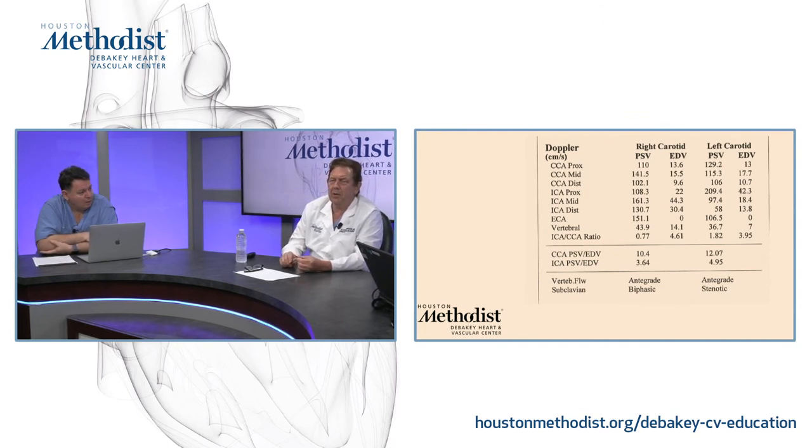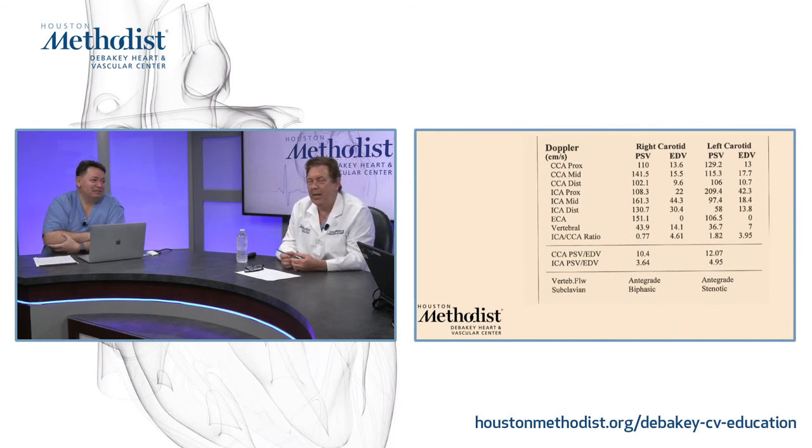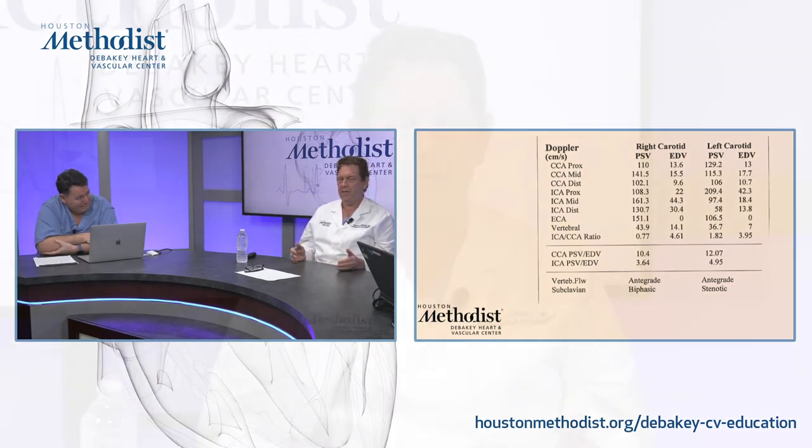I mean, I guess I would have thought, scan the ICA, ICA is normal. Do I really need to bother with the ECA? Mm-hmm. Trying to help you here. Actually, we do have a separate protocol just for giant cell arteritis, for example. It becomes a really crucial part why we're looking for just a halo sign or velocity. Mm-hmm. We're looking for the IMT thickening of the ECA even from the origin. So I think those are the really important specific protocol points why the ECA is not just your black sheep. So the reason I'm pushing this is that we're very fortunate here in that the imaging is all inside the heart and vascular center.